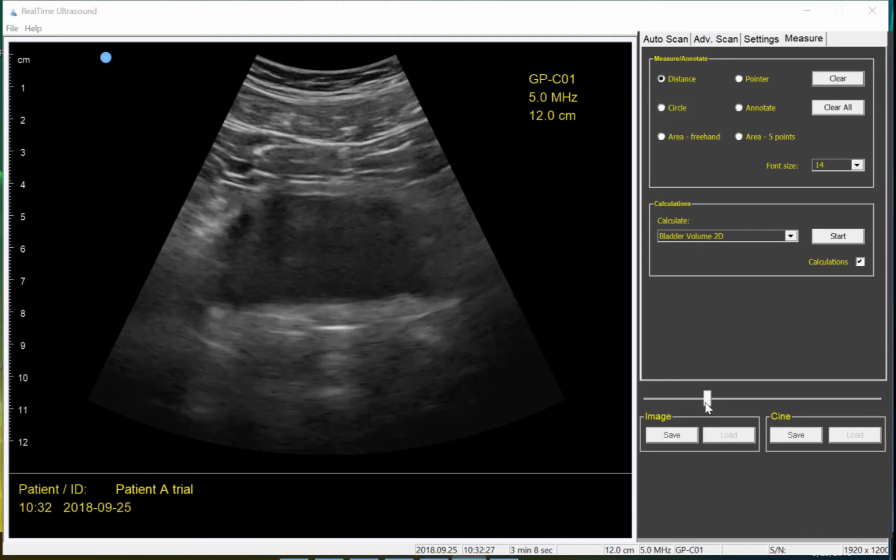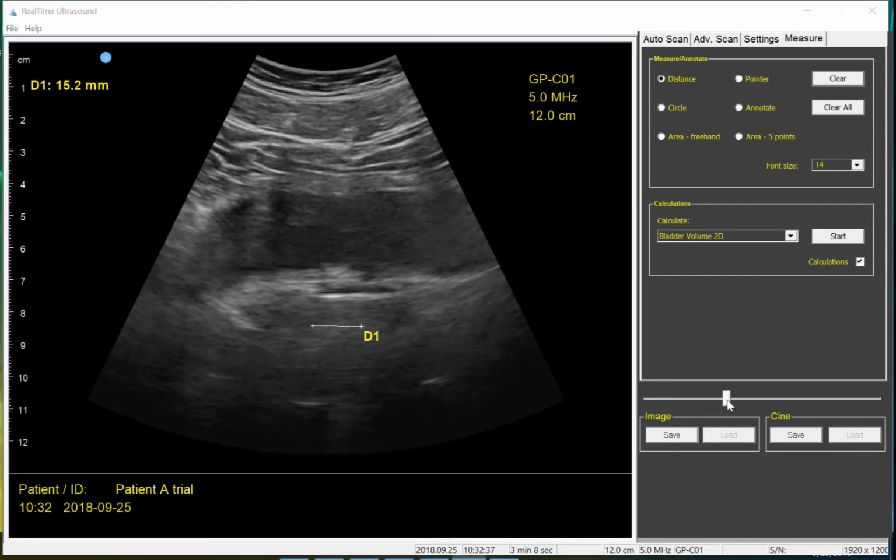Now that was using the bladder base. There's another landmark, the vaginal stripe, and this is an excellent landmark on some patients. I really like it when you can reproduce it. In that case, I started in the valley instead and then went to the peak. No guarantees, nothing that you have to do one way or another. We just don't have data that says one is better than the other. So, 10.6 millimeters.